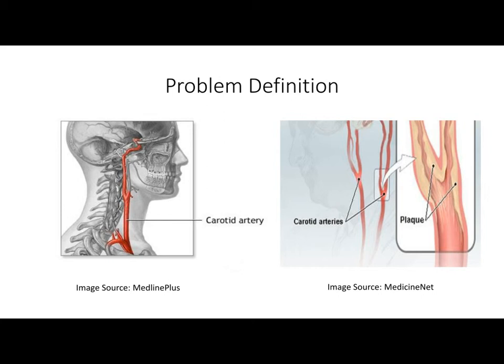An important and preliminary diagnosis is to listen to the arteries in the neck using a stethoscope or a Doppler ultrasound device. However, it's sometimes very difficult for a non-professional physician to differentiate between a normal and abnormal sound due to blood flow blockage. So there is a need for a low-cost and yet efficient screening method for the detection of the carotid artery diseases.